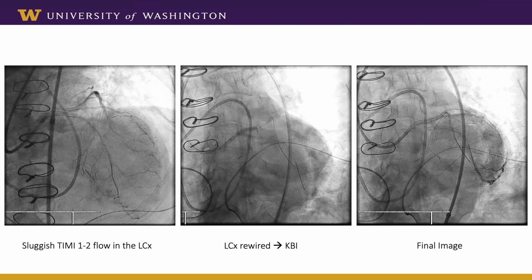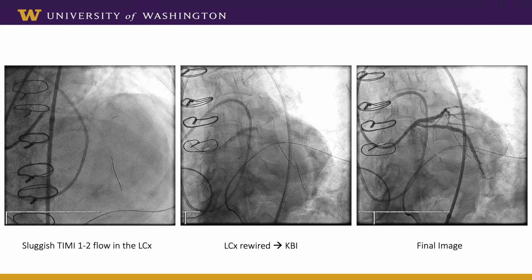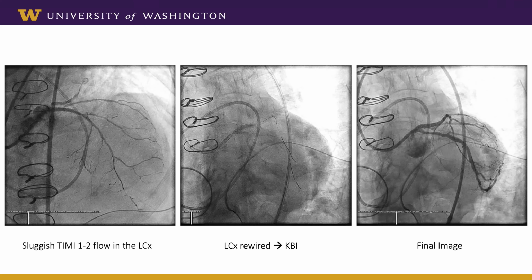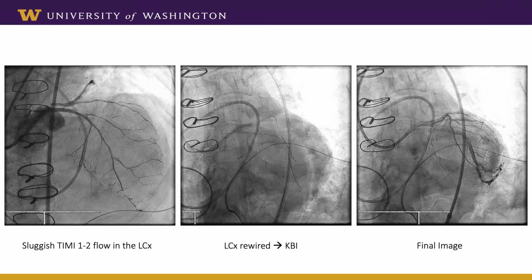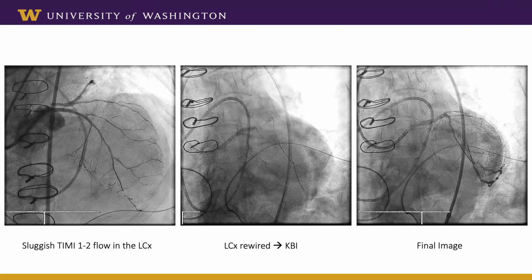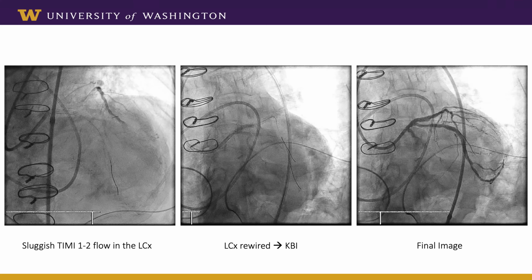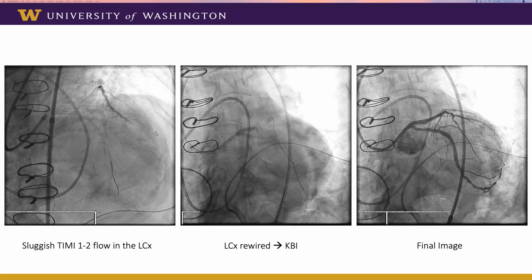That's actually one of my takeaways. When Kenny and I were talking about this earlier, I think one of the dangers of imaging is there was enough disease, and I was hoping to keep this a pretty quick case again because of the heparin issues and bleeding and stuff, and figured, well, either way a culotte would be our strategy, so it wouldn't change things dramatically. But I do wonder if we just made things worse by pre-treating. It was focal enough that it might have just been fine, even though it doesn't look good on imaging.